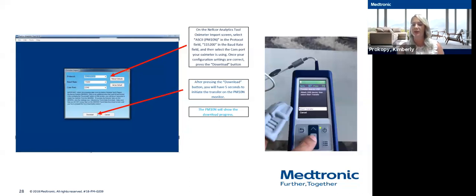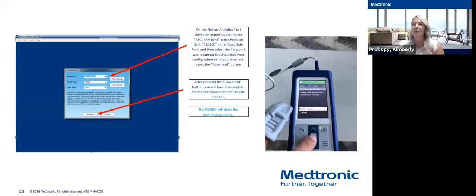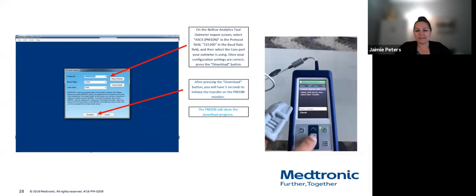I know, with the printout, you could see the full report as it was happening, and I understand because I'm an RT as well, and I also love the printout. But unfortunately, the way that technology is going is they want to do everything by Wi-Fi. They want to do everything by hooking up to your computer and transferring data, and all those lovely printer oximeters are all being discontinued. Yeah, it seems like let's keep things simple, but I don't know.